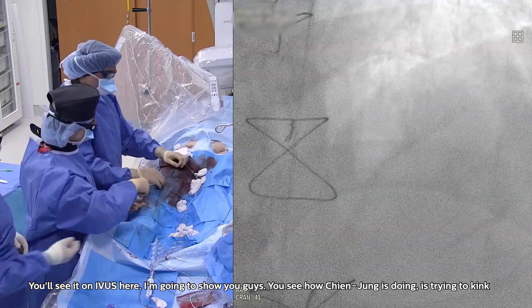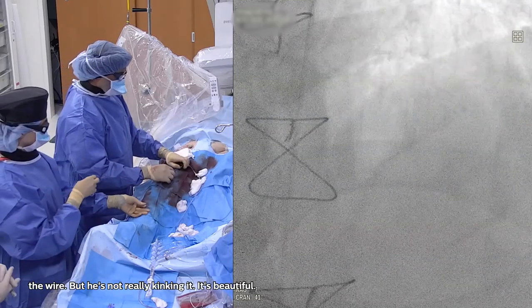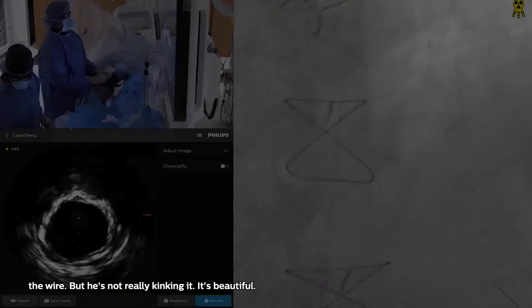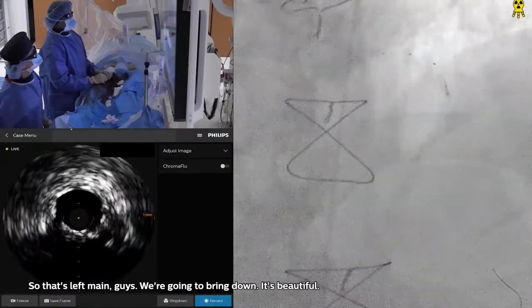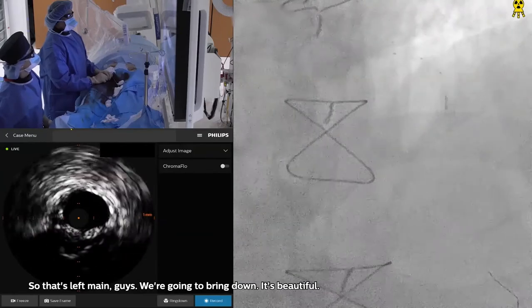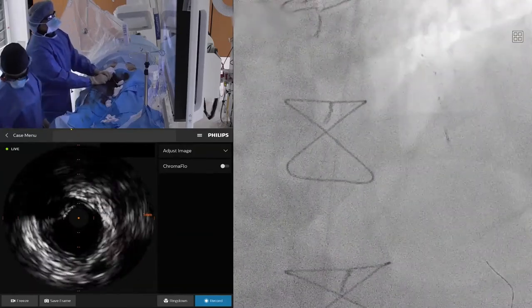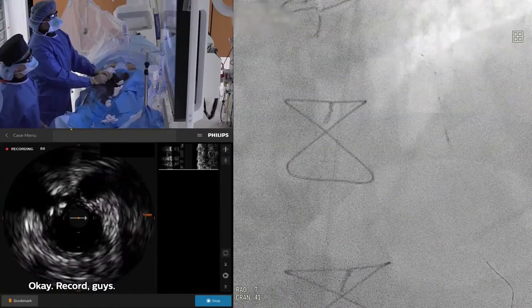So you see how fast Shenzhong is doing? He's trying to kink the wire, but he's not really kinking it. It's beautiful. Ring down. So that's left main, guys. We're going to ring down. And we'll take this thing. Oh, it's beautiful. Okay. Record, guys.